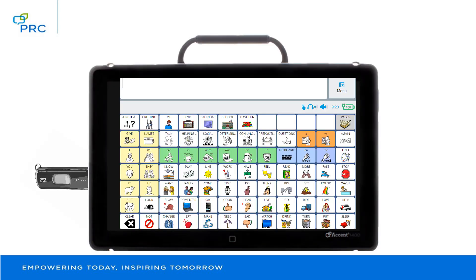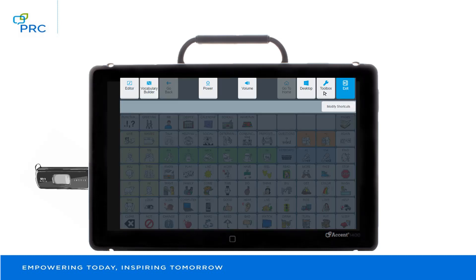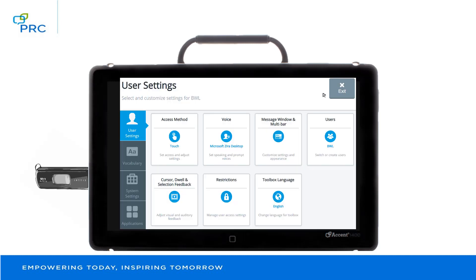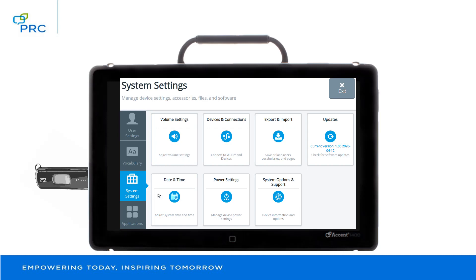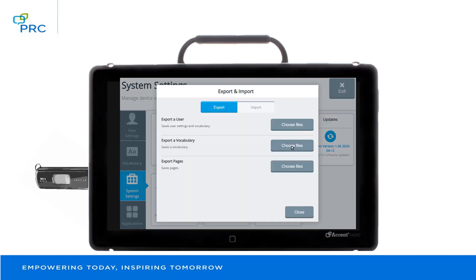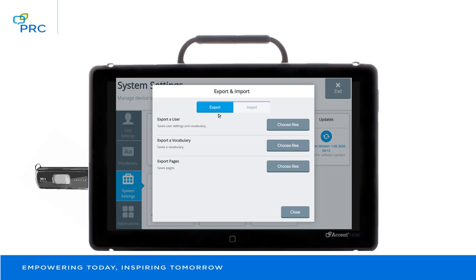Let's look at how to export a user file. First, we're going to select Menu, then Toolbox, System Settings, Export and Import. From here, make sure that Export is highlighted. You can see you have a choice to export a user, a vocabulary, or pages.